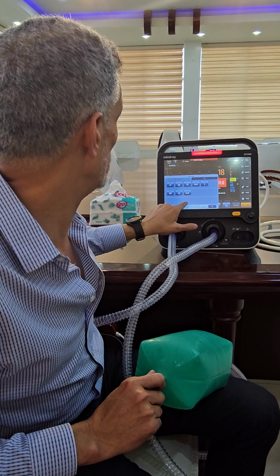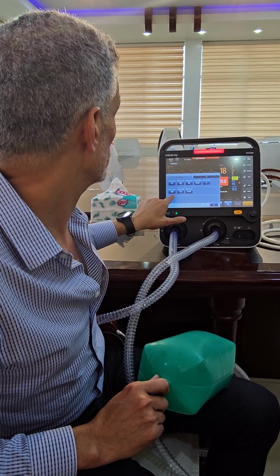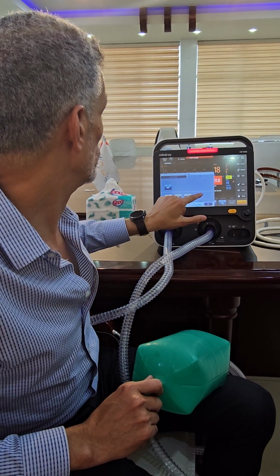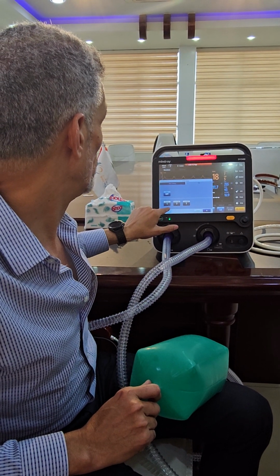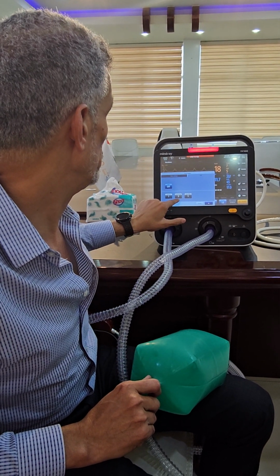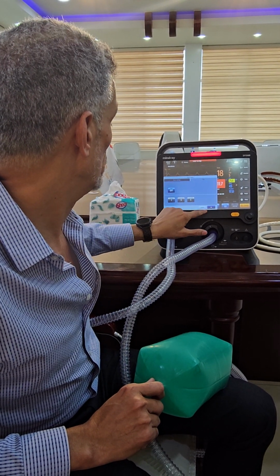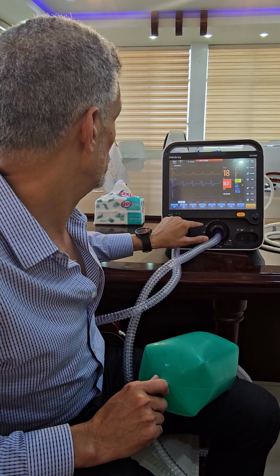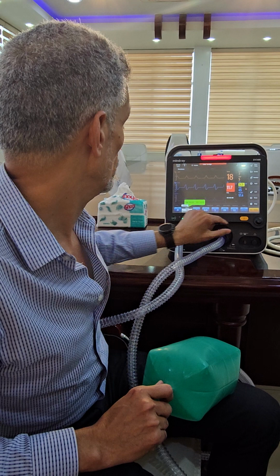Where is the flow here? Do you see the flow? 35. No, this is the frequency. So if we go to flow, inspiratory cycle, inspiratory pressure. I think we've also talked about the PIP. Where is the PIP here? So let's get more.